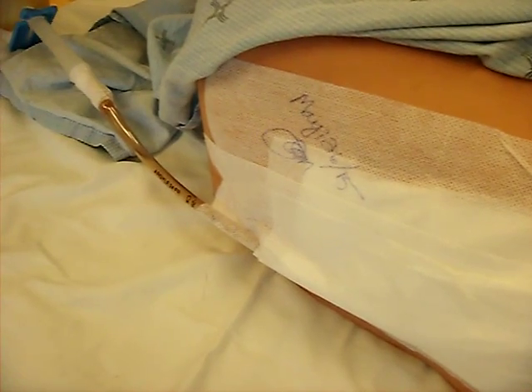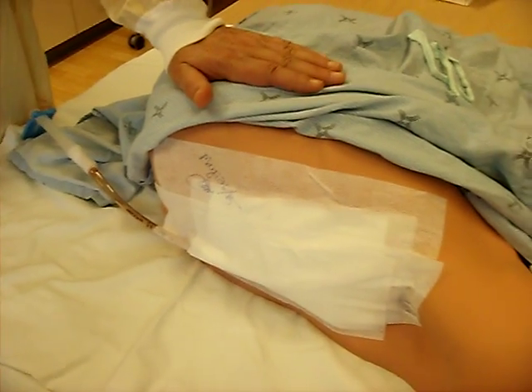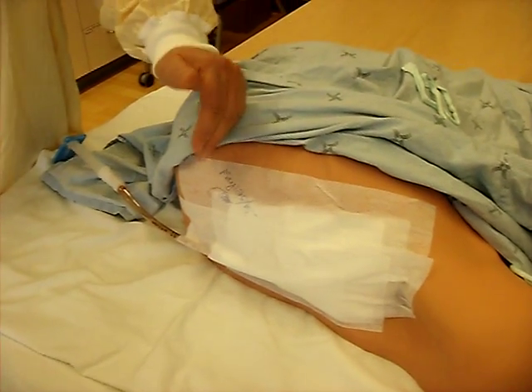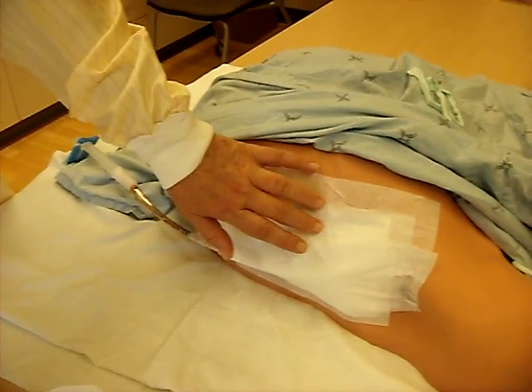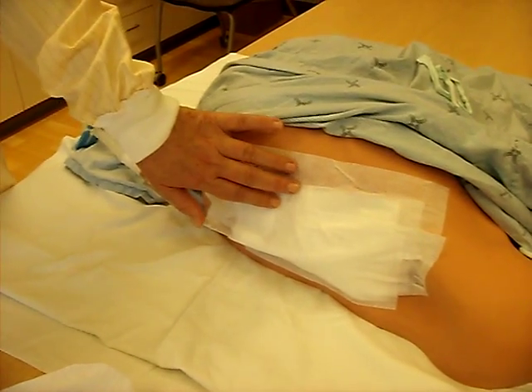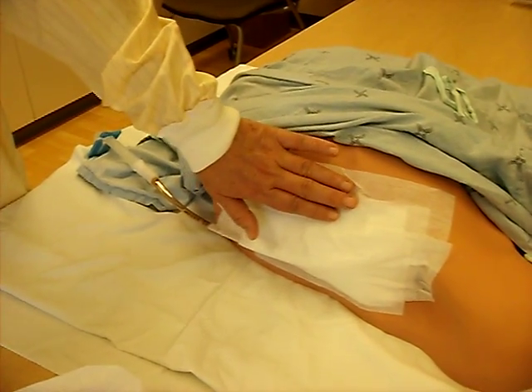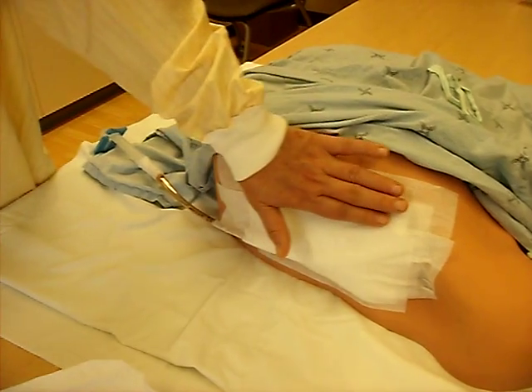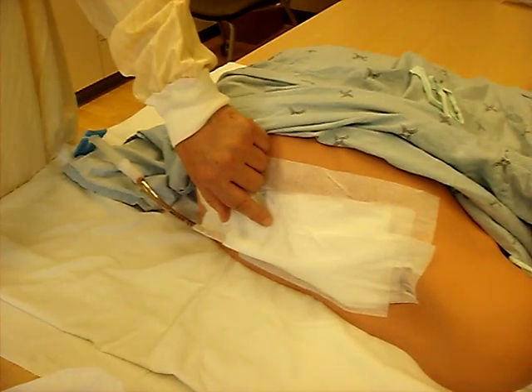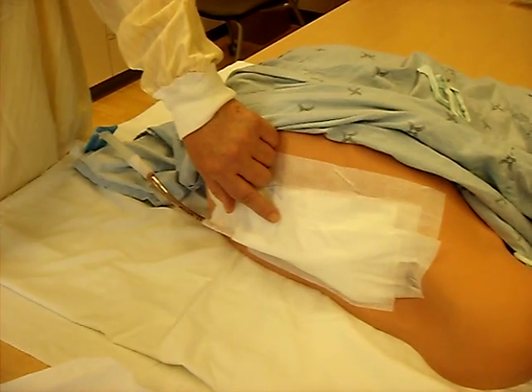Prior to removing the chest tube, you also need to auscultate the patient's chest and perform a chest assessment. You want to look for any crackles or wheezes that might be present, any decreased air entry, and certainly do a palpation around the dressing and surrounding tissue to make sure there's no leak of air, which will be indicated by subcutaneous emphysema. It'll feel like bubbles, or somebody once told me, Rice Krispies under the skin. It'll be very, very obvious. If you do feel that, you will absolutely need to mark that area on the patient's chest so that you can mark whether that's increasing or resolving.